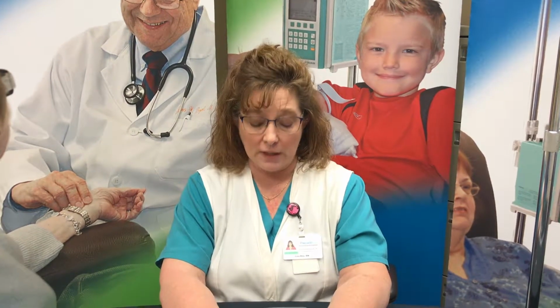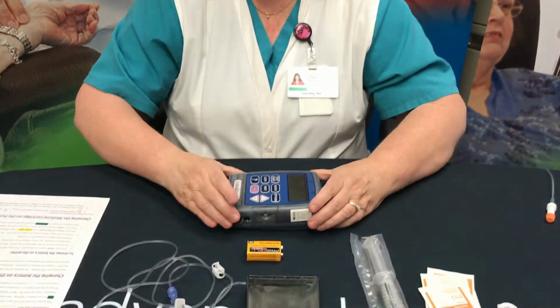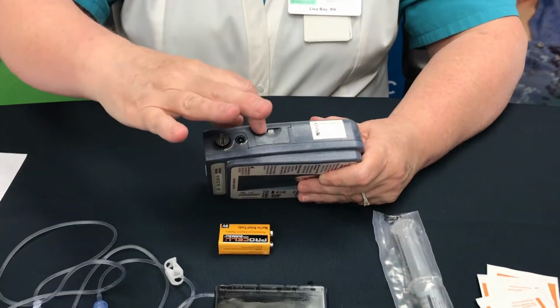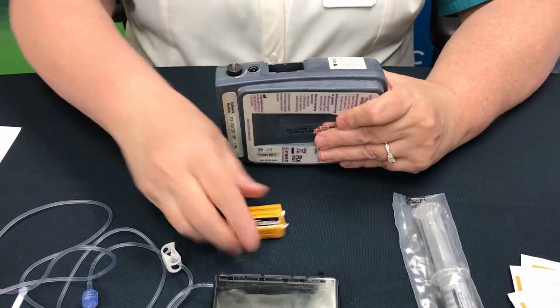The backup cartridges do need to be kept in the refrigerator until they are attached to your pump, and you will need to take them out at least an hour before you attach them for them to come to room temperature. So in order to get this new cartridge attached to my pump, I'm going to begin by opening up the battery door. There is a white button that I'm going to press and the battery door comes off.